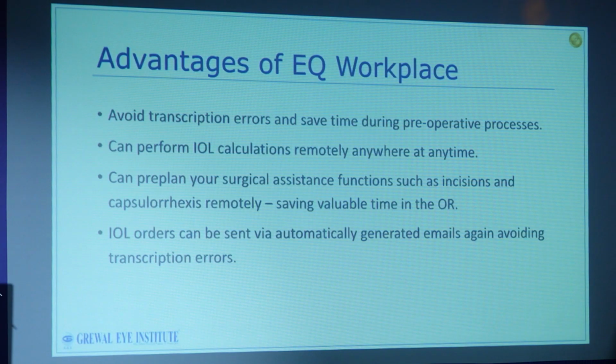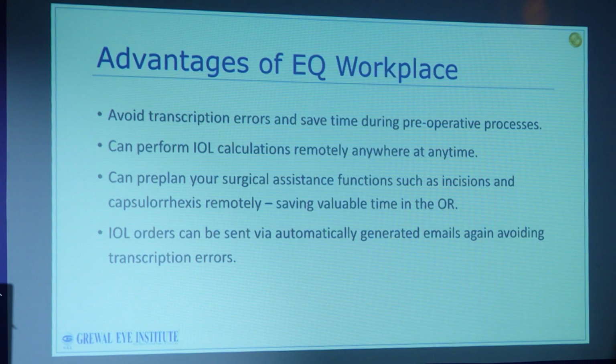all the work-up examination is done on a biometer. That data comes to you seamlessly in your office. You look at it, you talk to the patient, whatever IOL they have, you have the data readily available over there. Anything you want to change or alter in the data, you can do that. Now, you don't have to keep going back and forth between machines to find out whether you are suitable for a premium presbyopia correcting IOL or not. All that information is readily available to you.